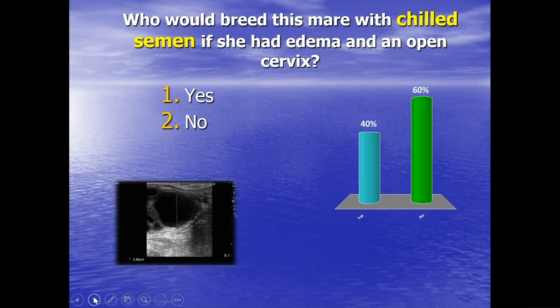But if it was late in the season, I'd discuss it with the mare owner. Especially our well-educated owners, who are always the best ones, by which I don't mean general education, I mean those who know quite a lot about mare gynecology, I would show them on this. I'd say, look, we've got this kind of conflict here.